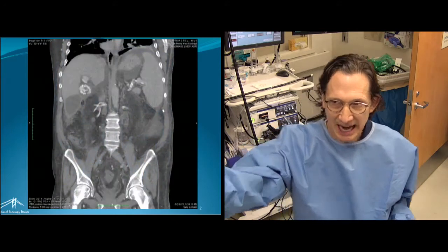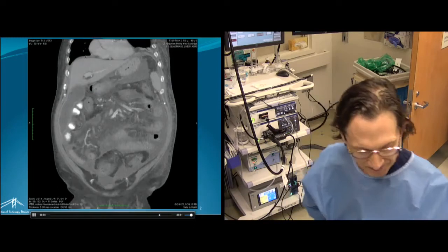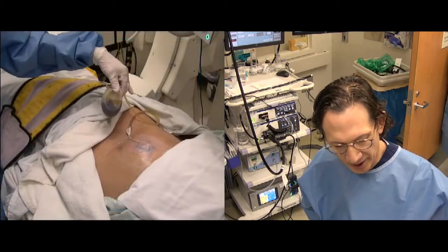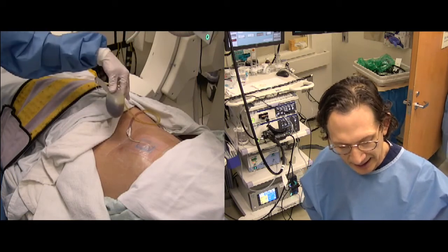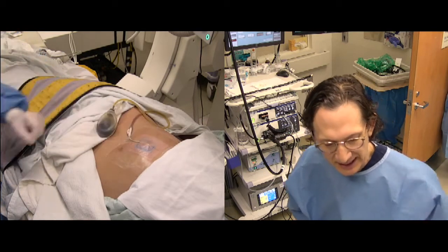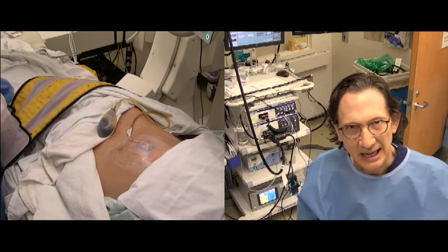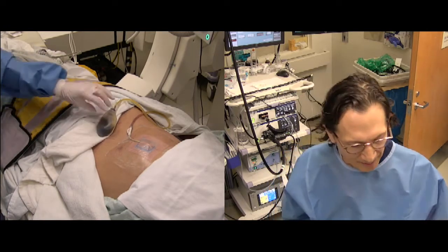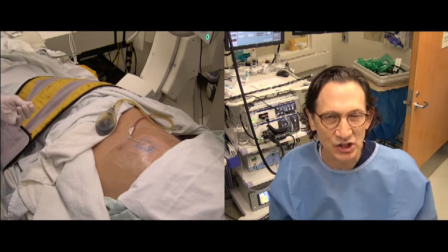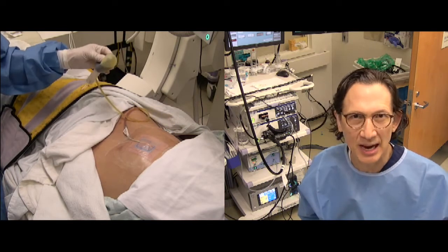Now, if you can switch to the camera to show his abdomen, you can see the cholecystostomy tube in place. And there we go. So you can see here's the collection reservoir here with some bile inside of it. Everything here, the dressing is on. And this is really for these patients, the issue of quality of life. You know, he carries this pinned to his shirt so that he knows when he needs to empty his reservoir. And that occurs a half a dozen times a day.